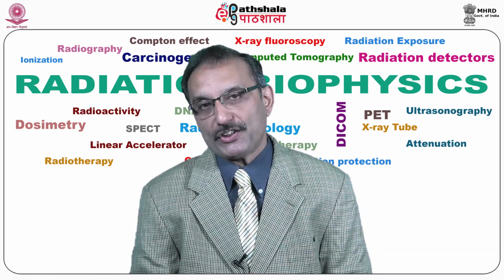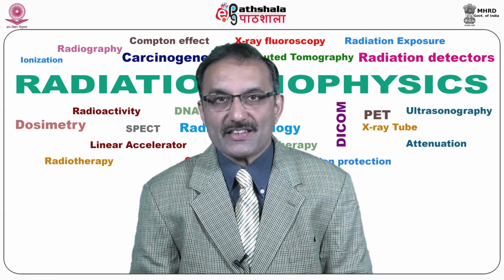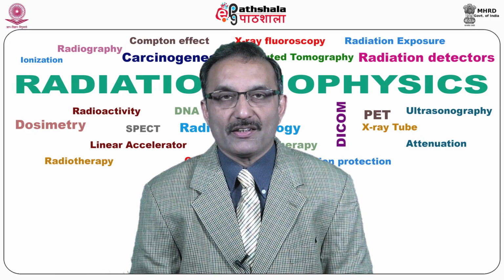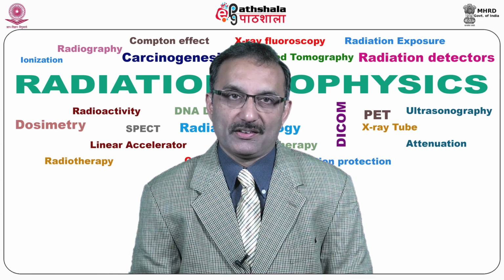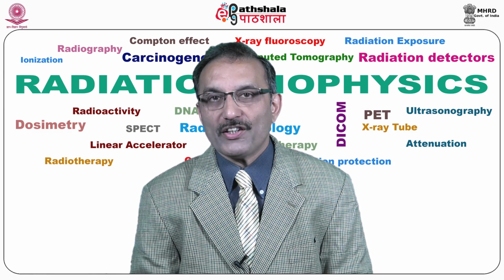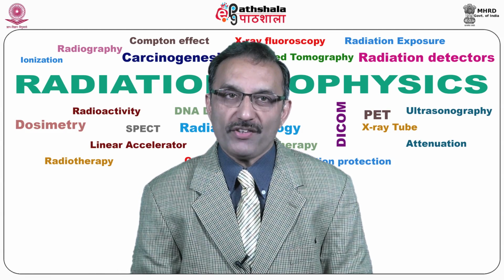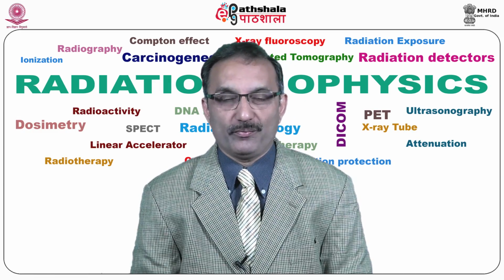As we talk about a special device, what is this device? This device is nothing but a combination of detectors where the radiation which is coming out from the patient is detected. The device used may be a gamma camera, or nowadays for molecular imaging techniques we use positron emission tomography, and earlier when we started we were using a scanner or probe.